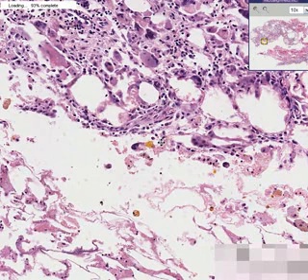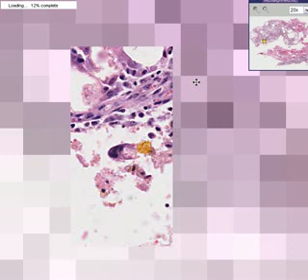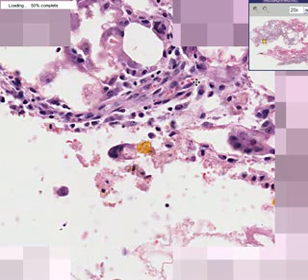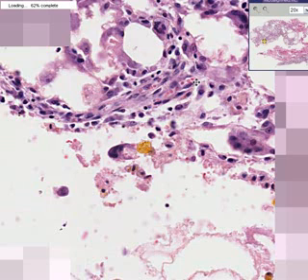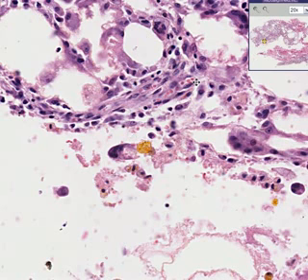So this is a classical appearance for fat necrosis, in which you see foreign body granulomas, giant cells, and hemosiderin within macrophages. The usual most common cause for fat necrosis is trauma, either surgical trauma or external trauma. And the basic pathophysiologic process is that trauma to fat tissue sets up changes which the body reacts to by creating foreign body granulomas to eat up all the ruptured fat tissue. And the macrophages gobble up the hemosiderin.